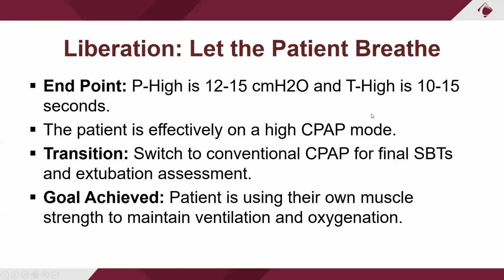Now, here's where I want to caution you. They're almost pretty much doing an SBT, but if you want to do one as an official SBT, please don't do pressure support over CPAP 5/5. And again, if there's anything I want you to take home from this talk, it's the mean airway pressure. If you have a CPAP of 12 to 15, your mean airway pressure is two less than that number, okay? But if you take them all the way down to a 5/5, you're dropping their mean significantly. You're going to most likely cause atelectasis during their SBT, okay?